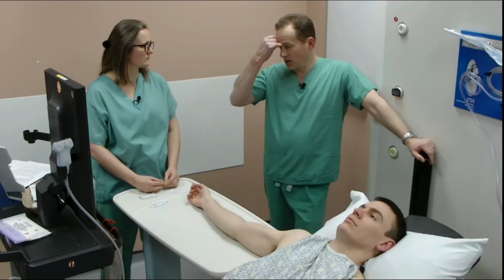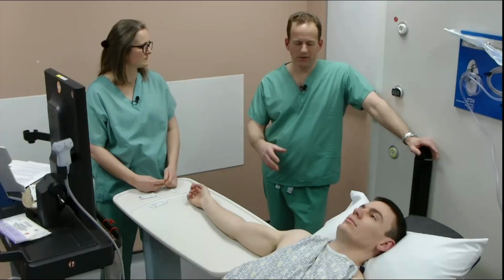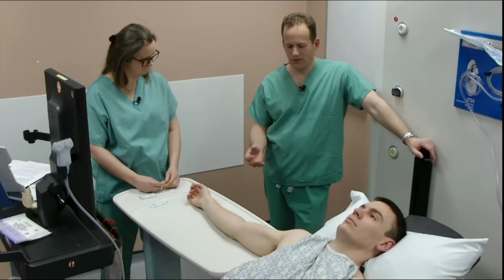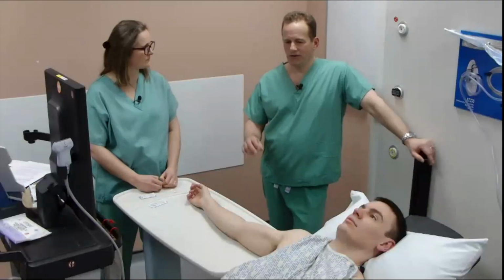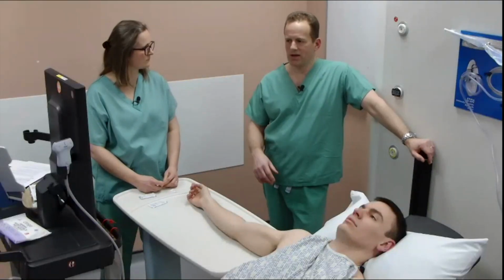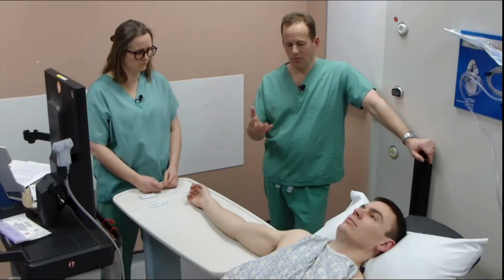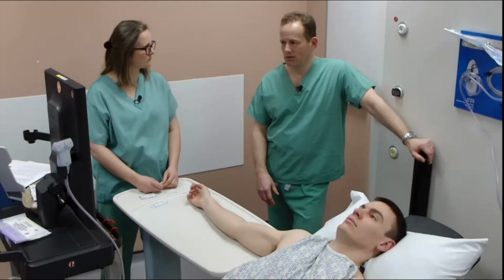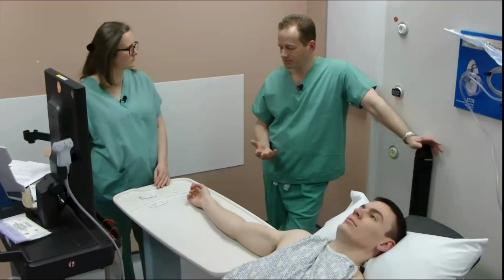Going back to when I started training, regional anaesthesia was the domain of a few experts who could master nerve stimulation and the vagaries of paresthesia techniques, and if you didn't know how to do that, it was a real art. Whereas now we can see individual patient differences, and our blocks can therefore become more reliable. So ultrasound has made it more reliable, and hence people are more willing to try it.